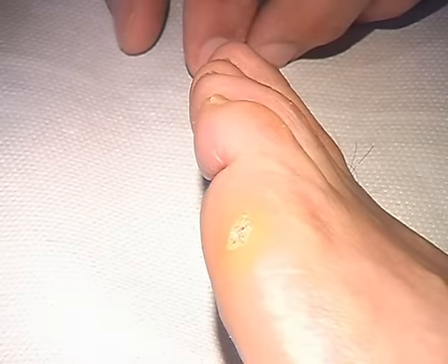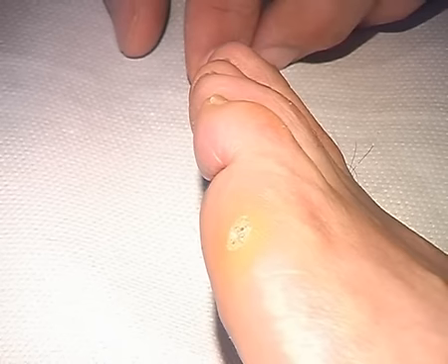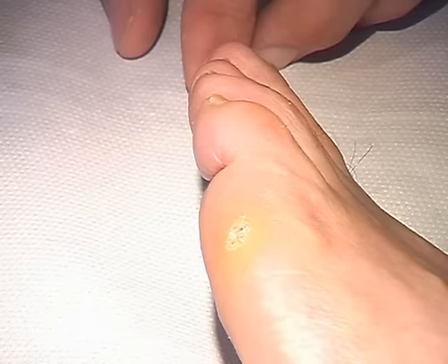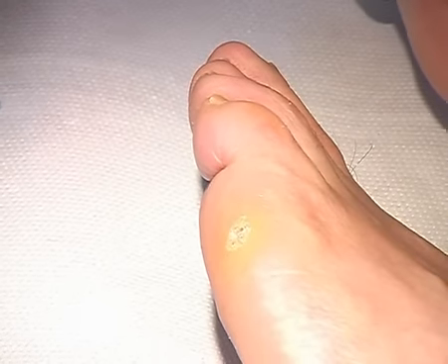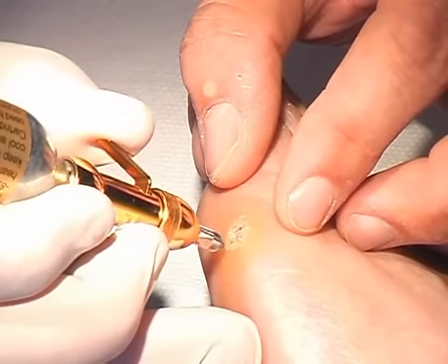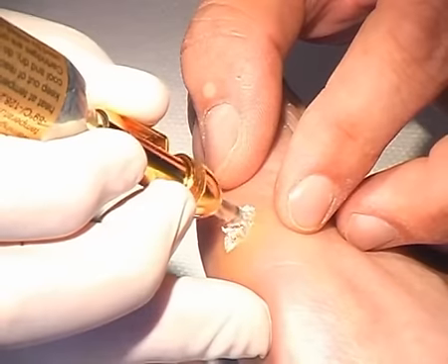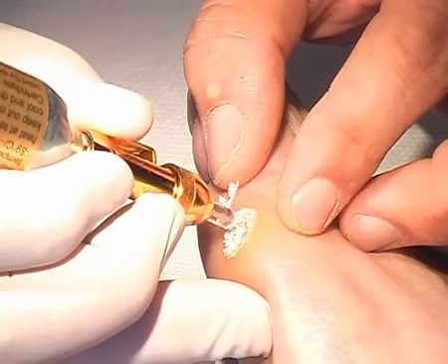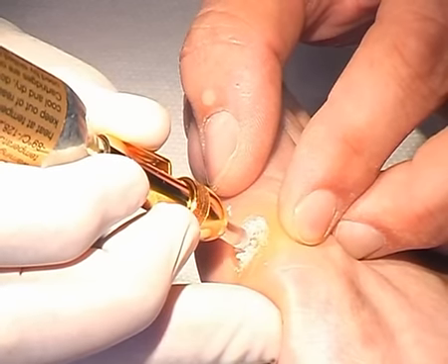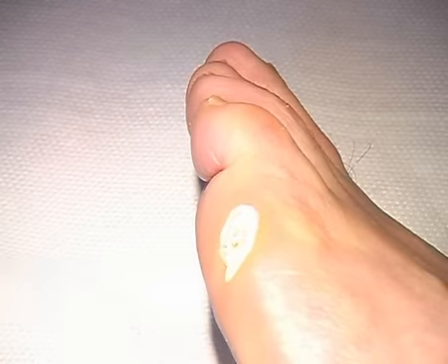This 40-year-old patient has a 2-year-old plantar wart on the lateral part of the left foot. Looking at this kind of wart, it is recommendable to execute a curetage prior to any treatment. This time, the treatment is done without any curetage. These plantar warts are deeply penetrating and a treatment time of 15 to 20 seconds is absolutely justified. Normally, one application is sufficient looking at this treatment duration. The patient felt almost no pain.